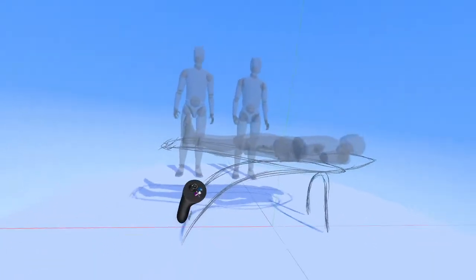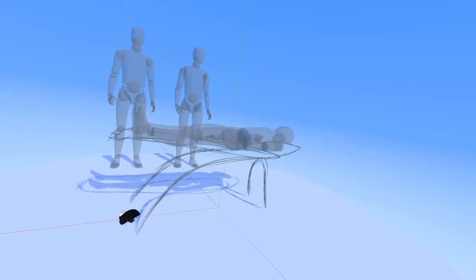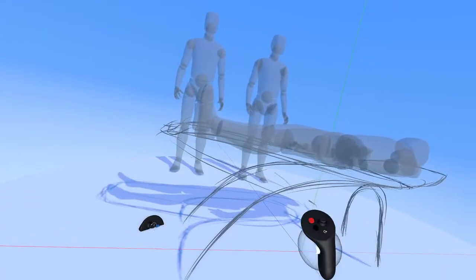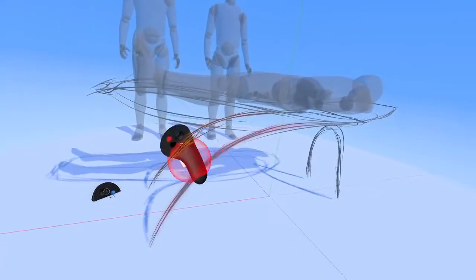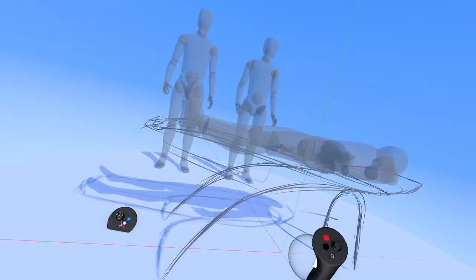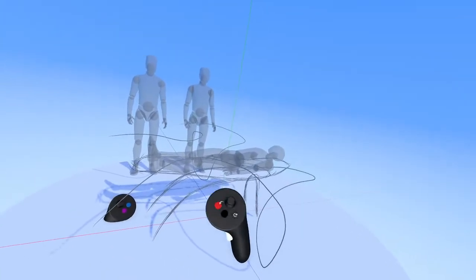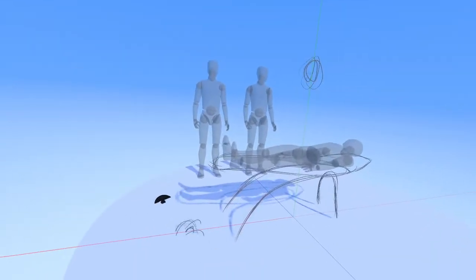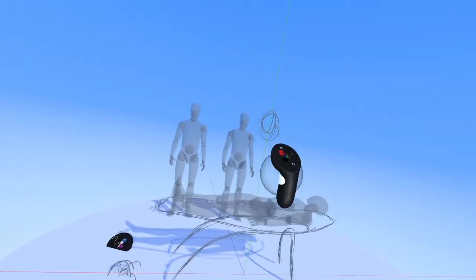Okay, so one thing I'm noticing here is I'm trying to sketch a side view for this bed. And it's very difficult to do this in Gravity Sketch normally, without applying any parameters, because we're sketching in 3D space, right? So each sketch line we make can be moving along Z, X, and Y. And what we want to do is constrain it so that it's between two of these axes, right? So we're only sketching along X and Y.